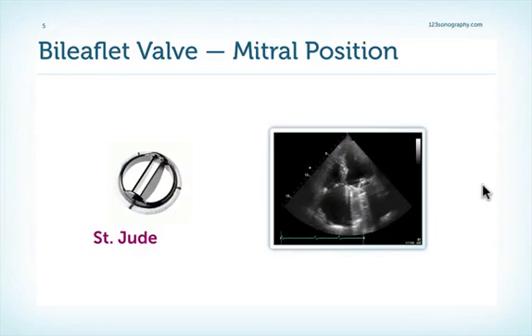Now let's turn to the bileaflet mechanical valves. Remember, we have two leaflets, and this is also nicely visible in the echo, in the four-chamber view. You can see how both leaflets open and close. As a matter of fact, they often don't open and close exactly at the same time. This is due to, first of all, gravity, and also to the flow, the different flow and the different hemodynamics in the region of the prosthesis.